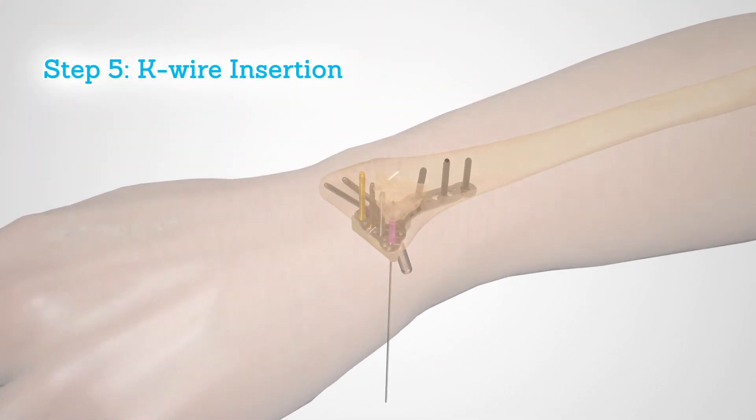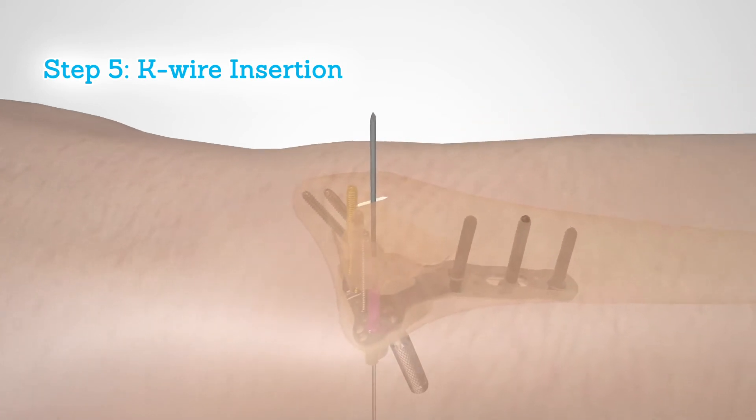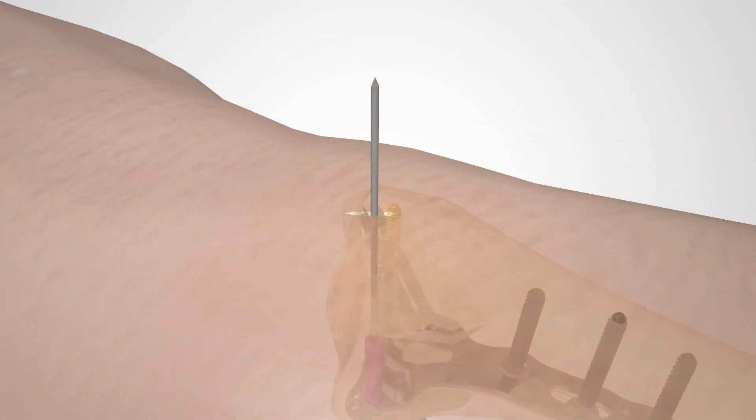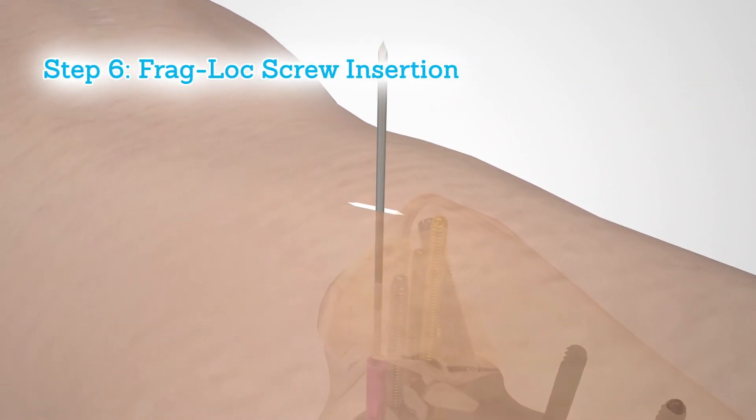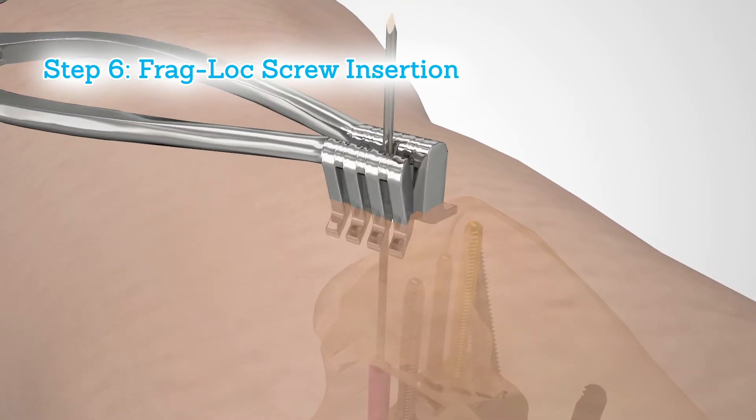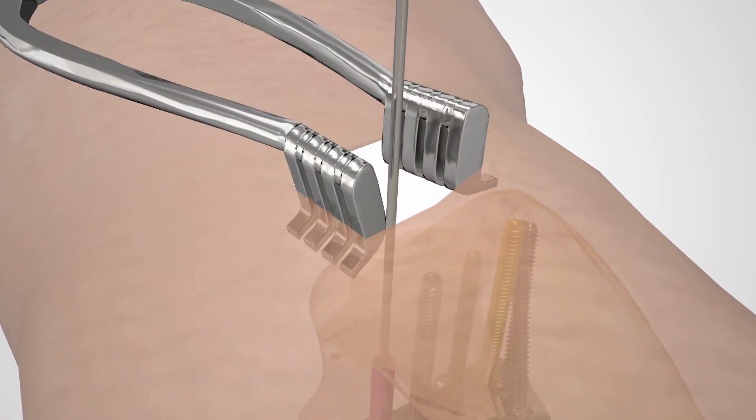Insert a K wire through the compression sleeve, passing it to the dorsal side of the radius. After making a small incision dorsally, a Heiss retractor is used to maintain soft tissue clearance.